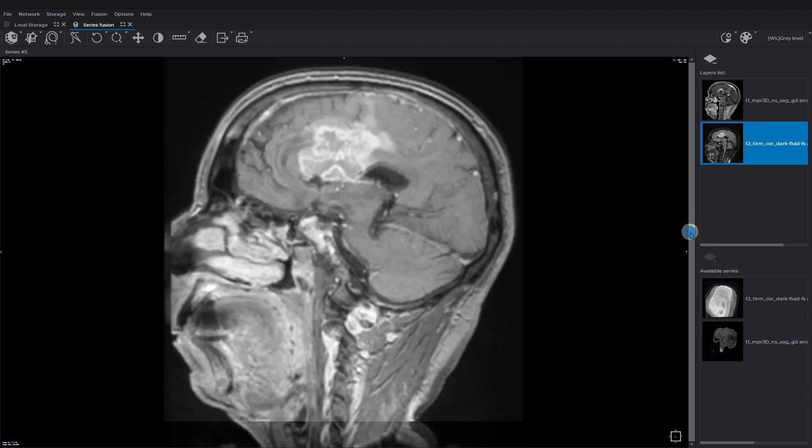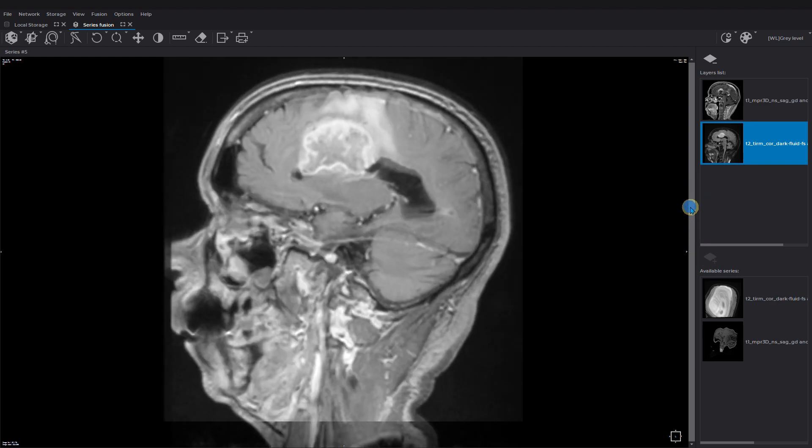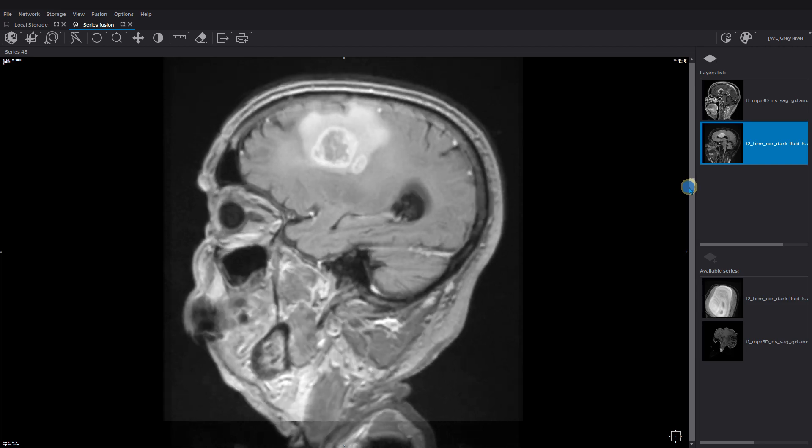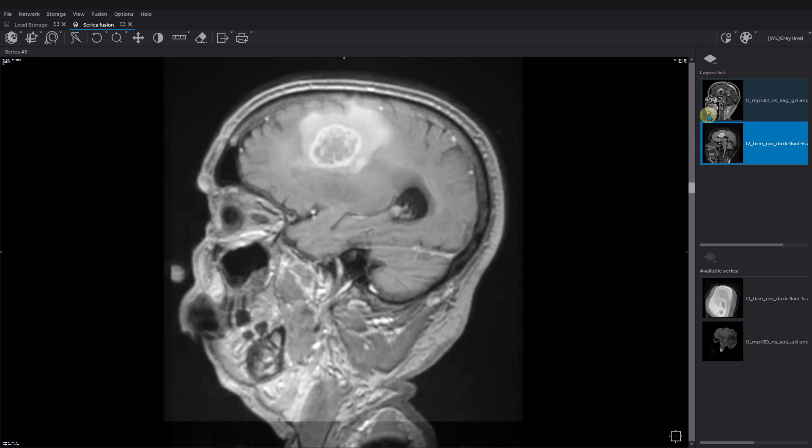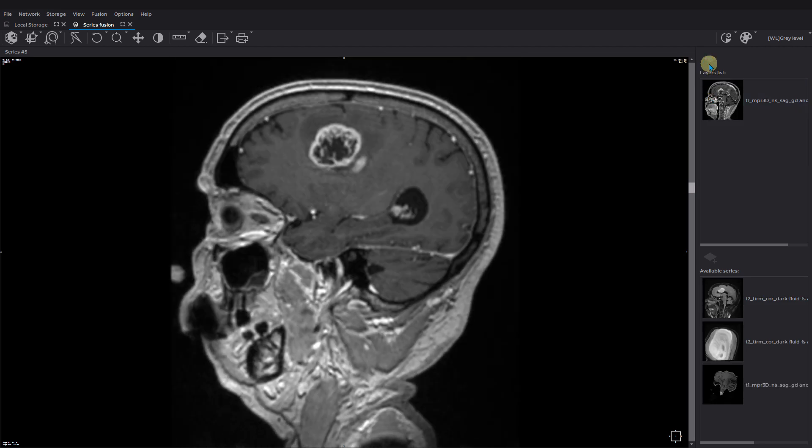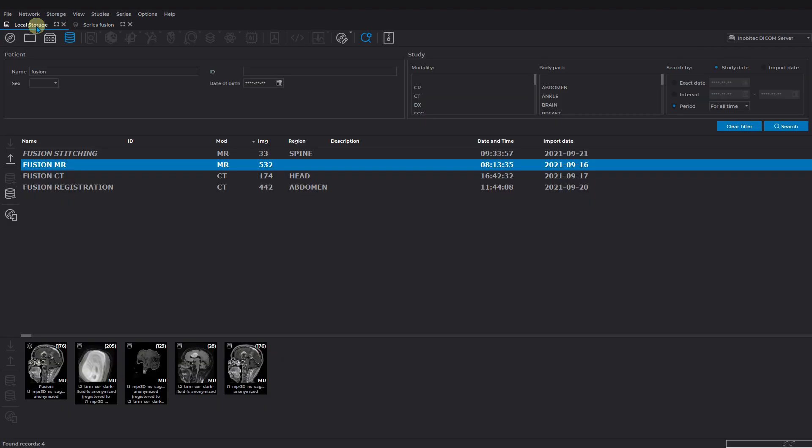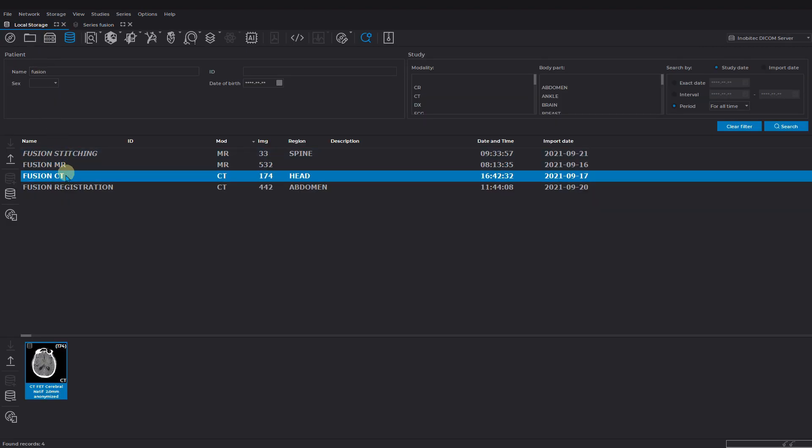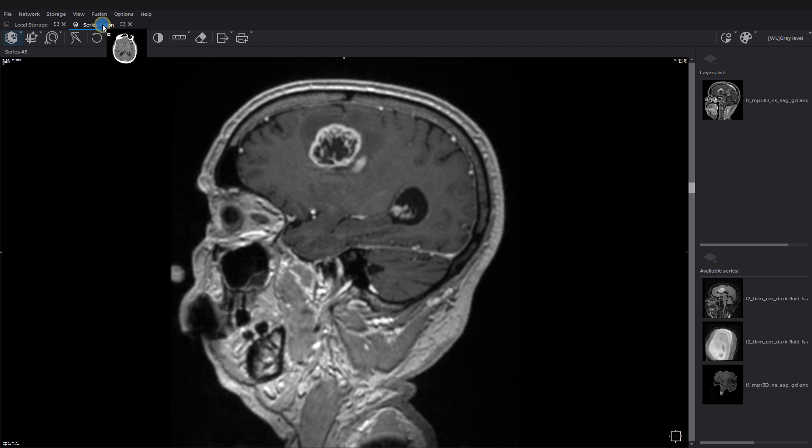To delete the series from the layers list, click on the remove button above the list. If you need to add series from a different study, select another study, then drag and drop the series to the fusion tab.